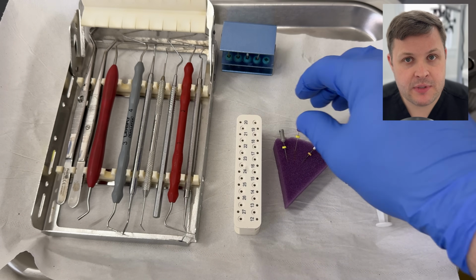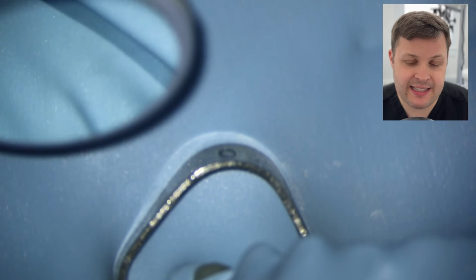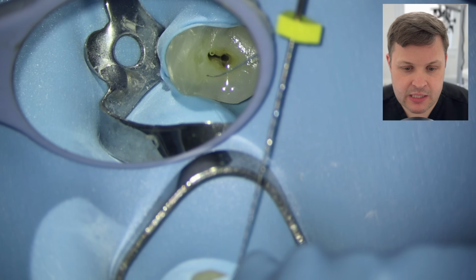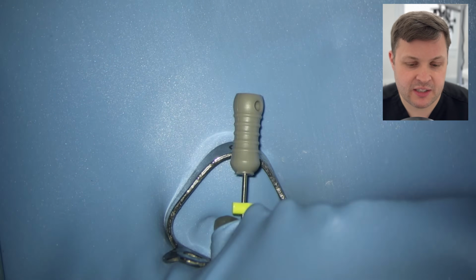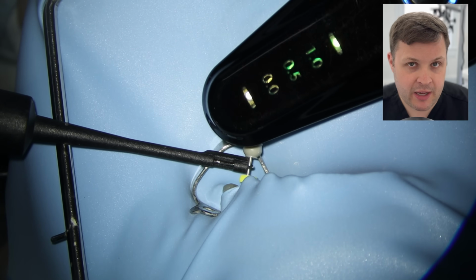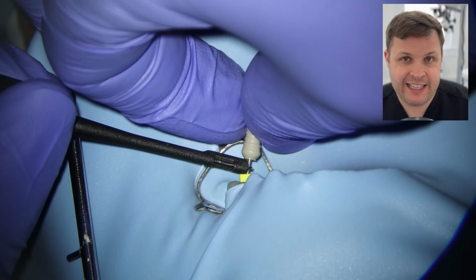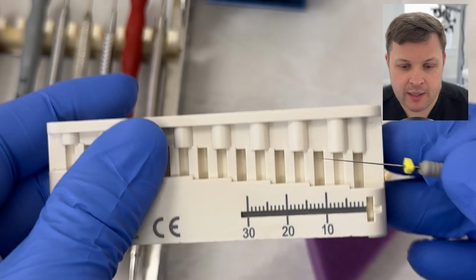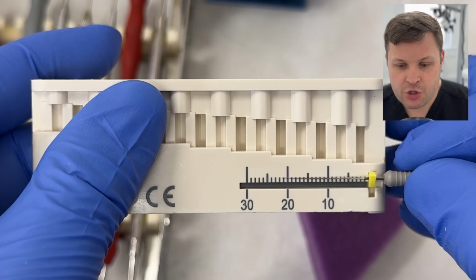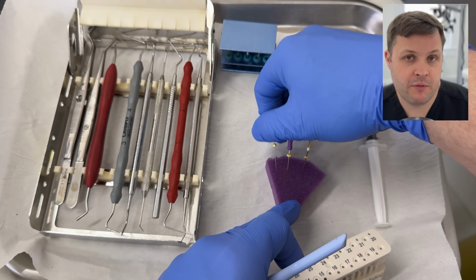We're then going to attempt to get our 0 reading on the buccal, and I'm going to use a size 8 D-finder here with a small bend. And as I reach this, I'm getting significant resistance. And when we hook up the apex locator, it notices that I'm not really getting to length. What I'm trying to do here is negotiate a little bit further, but I'm getting a bit stuck. So we notice that the furthest point reached with this D-finder is 21.5 millimeters.